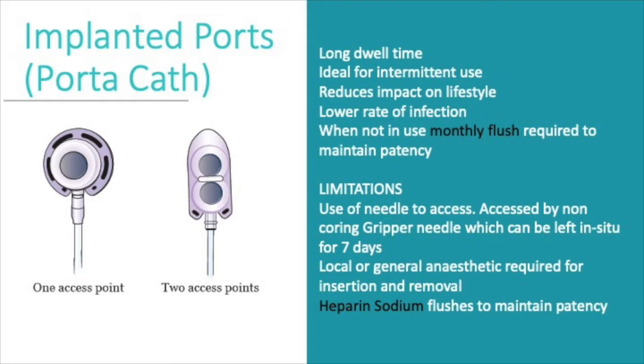So implanted port. Here I have a lovely model of an implanted port. Sometimes you can look across the room and directly see the implanted port sticking out from the patient's skin. Sometimes you can't. It literally depends on the amount of tissue the patient has. So the reasons that an implanted port is inserted is possibly chemo or the patient's on long-term IVs.